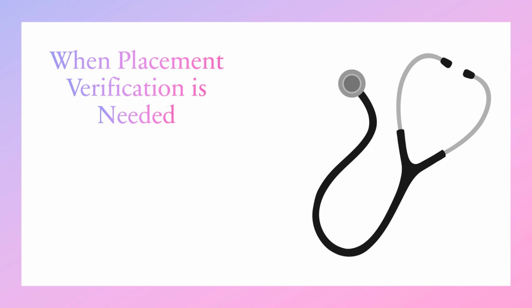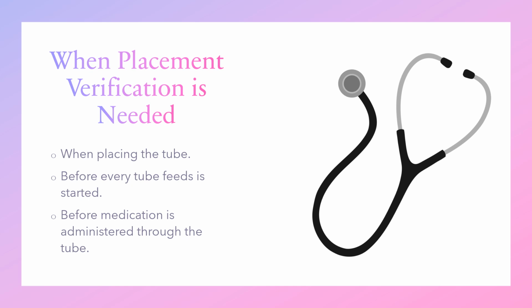When placement verification is needed. When you are placing the tube, before every tube feed is started, and before medication is administered through the tube.